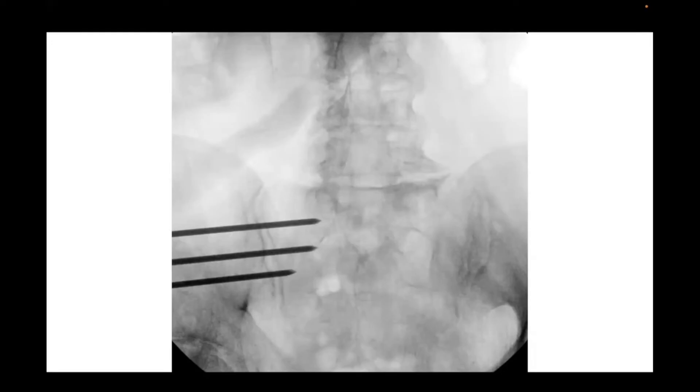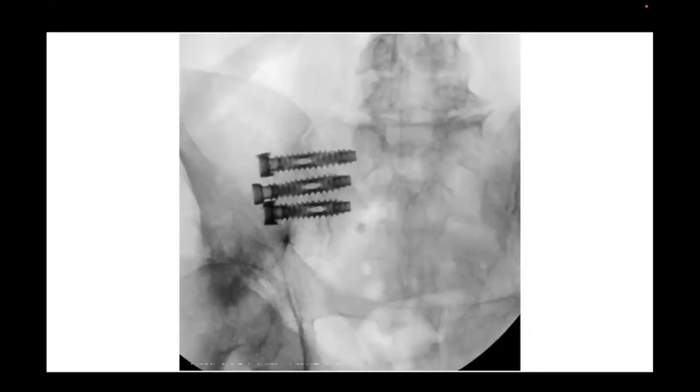Typically you place one pin just caudal to the alar line, straight down the bone, then place two more pins. Then check your inlet and outlet views and make sure you're lateral to the foramen. Depending on the system you're using, some allow you to decorticate the joint, some just transfix the joint, and then you place your screws. Some screws have caps that allow compression and some don't; some have self-harvesting coating properties. On the lateral view, that ventral screw may look like it's outside the sacral body, but it is in fact in the sacroiliac joint — something to get familiar with as you look at the imaging.